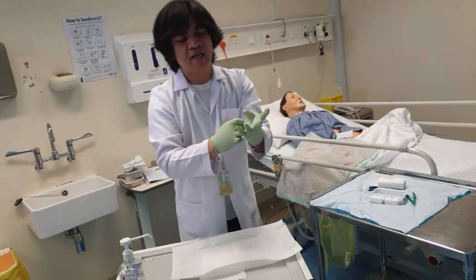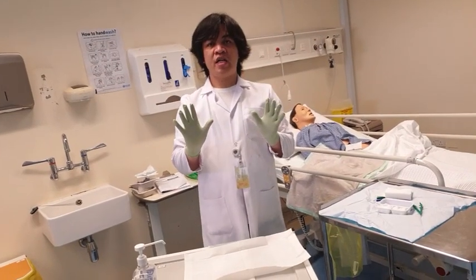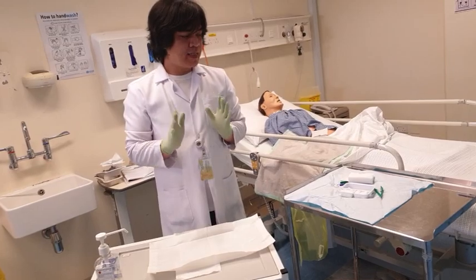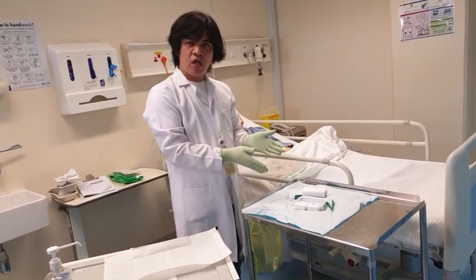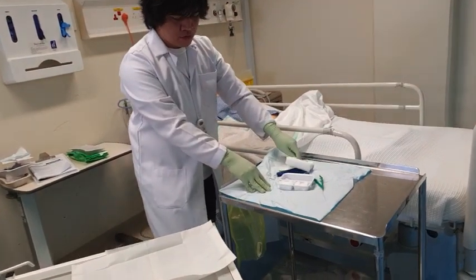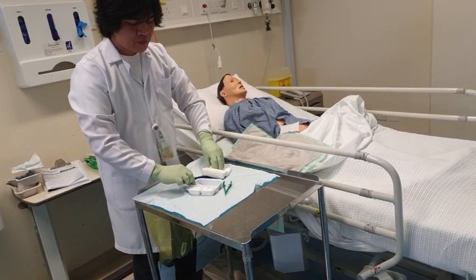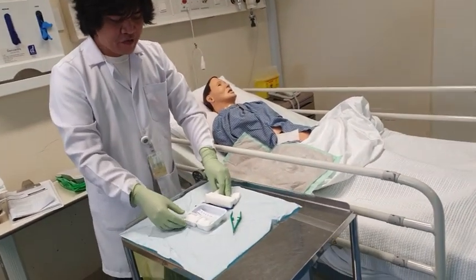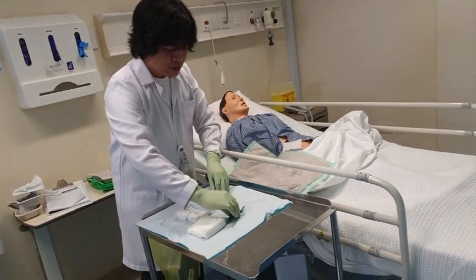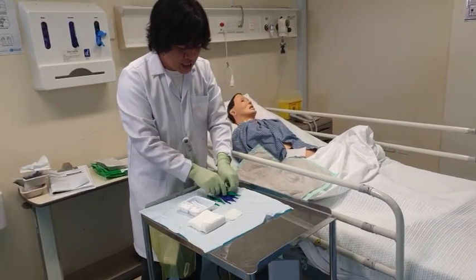Okay? And now you are wearing surgical gloves. Since I'm wearing surgical gloves, I can now touch the table with my gloved hand. Like this. And now, the first thing that I'm going to do is to arrange the table. And you will see that we have a couple of supplies here.